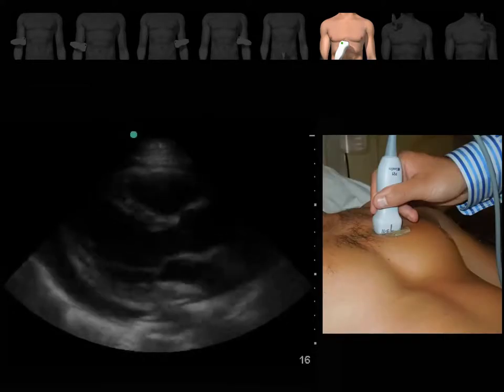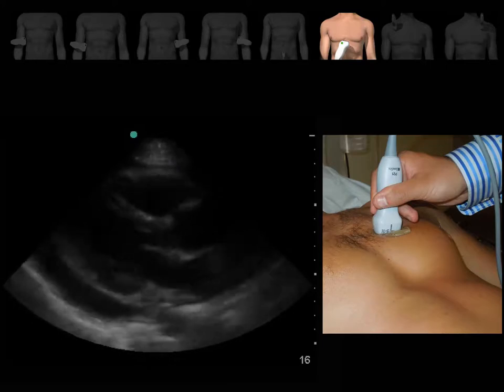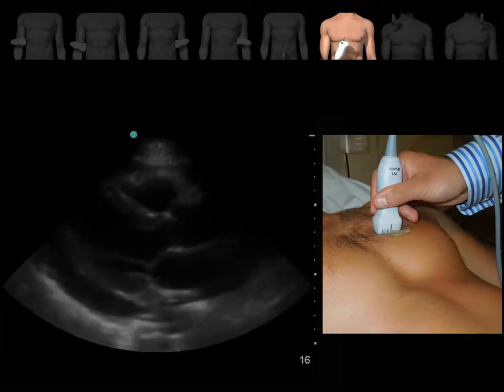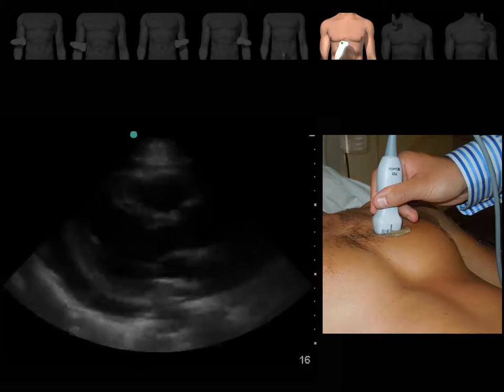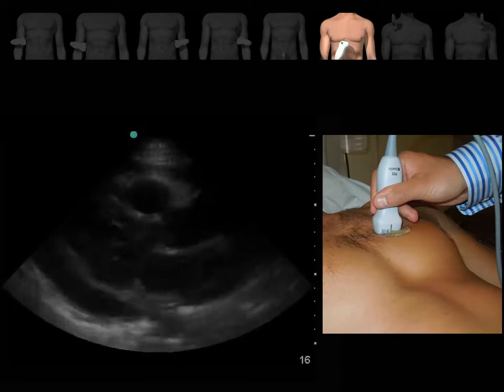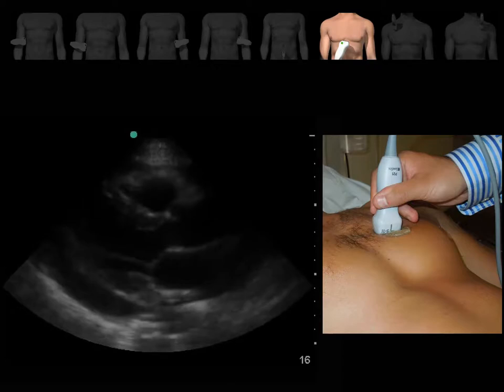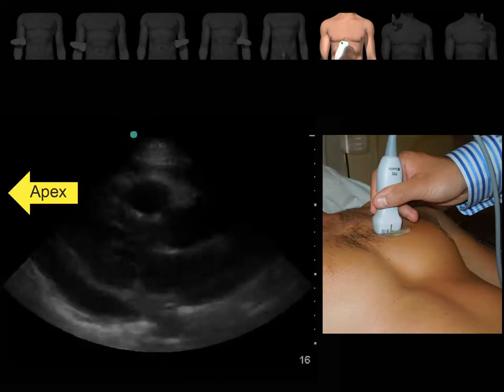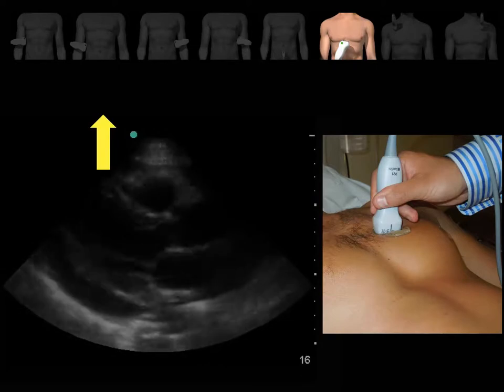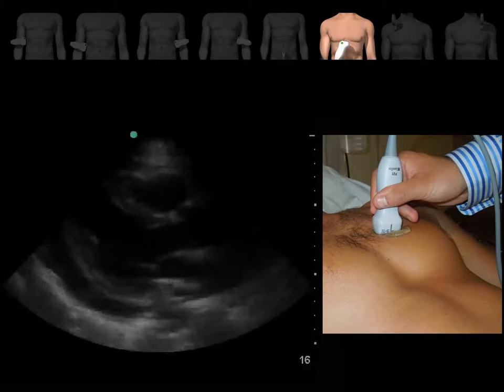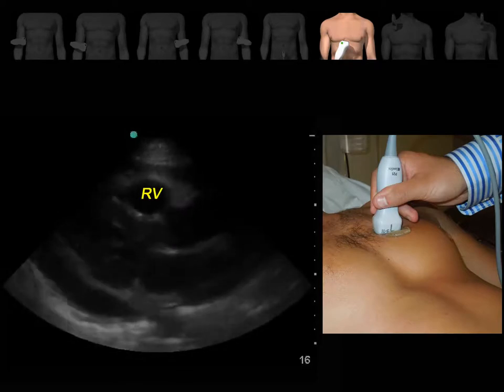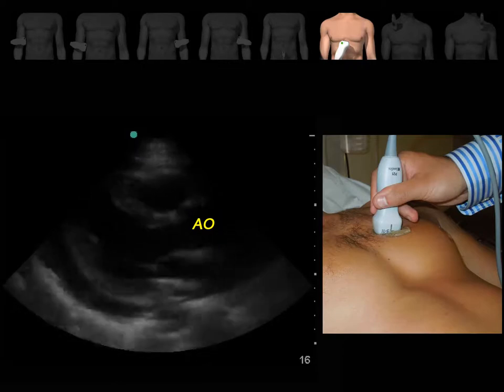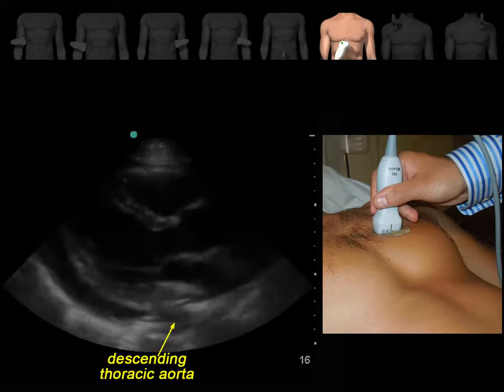The sub-xiphoid view could be difficult or uncomfortable for the patient in many situations, so feel free to use other views such as the parasternal long axis view. In this view, place the probe in the second to the fourth intercostal space just beside the sternum on the left side, with the probe marker towards the patient's left hip. The probe marker is towards the apex of the heart. The most anterior chamber is the right ventricle, followed by the left ventricle and left atrium. This is the LVOT and ascending thoracic aorta, the pericardium, and the descending thoracic aorta.